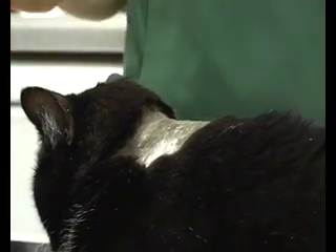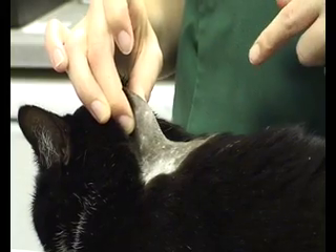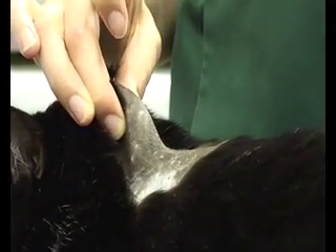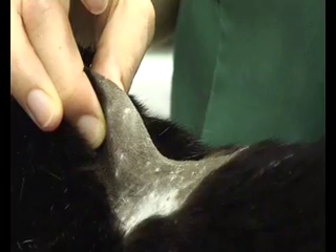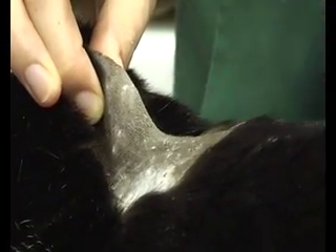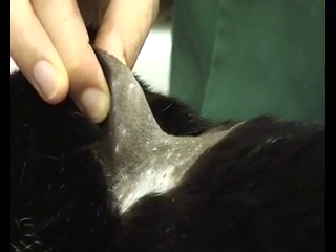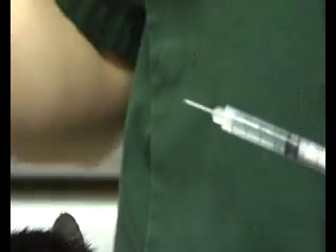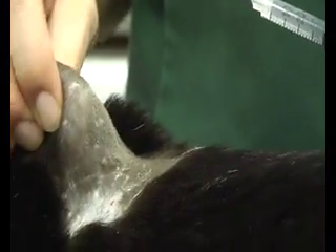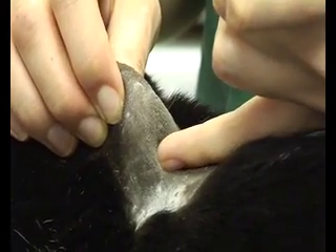First of all, pick up the skin with one hand and make a tent. What you're aiming to do is have a triangle of skin coming away from the area you've picked up, and you're going to be injecting into the base of that triangle. This is where you have the largest amount of skin space to go into underneath the skin. Take the needle, pick up the skin with your other hand and make a tent — remember you're aiming for the base of this triangle.